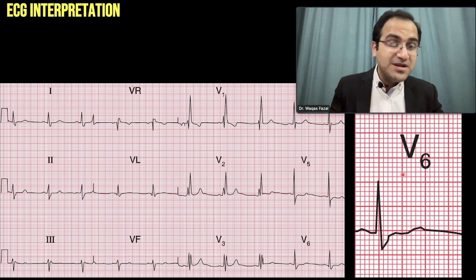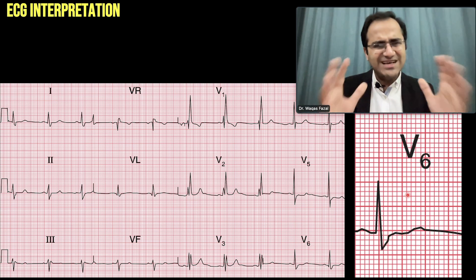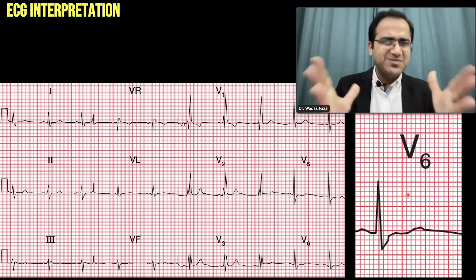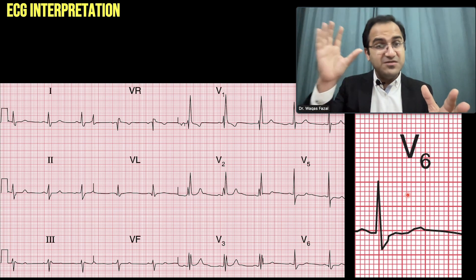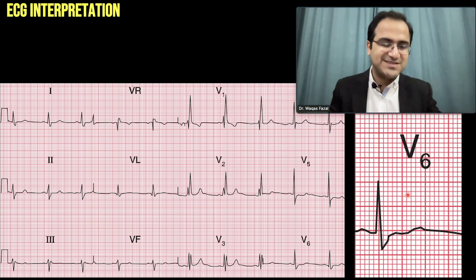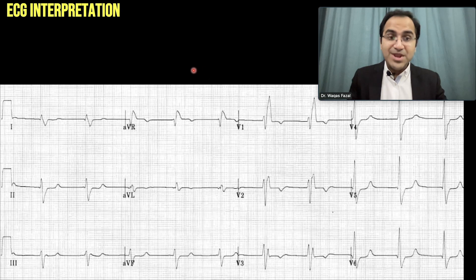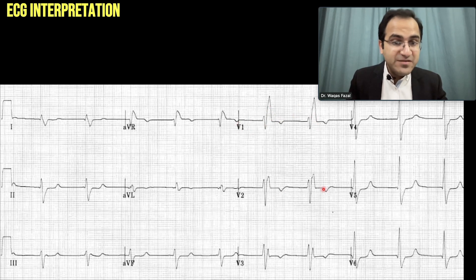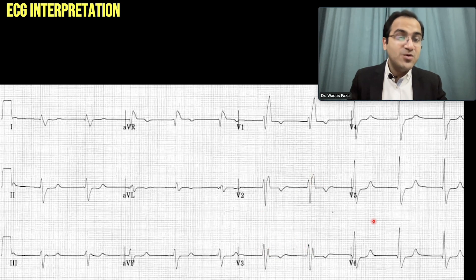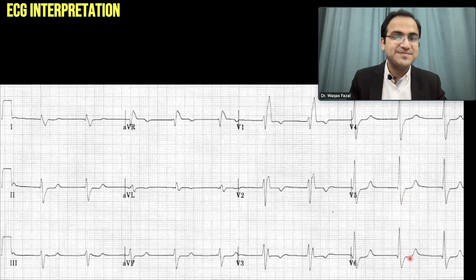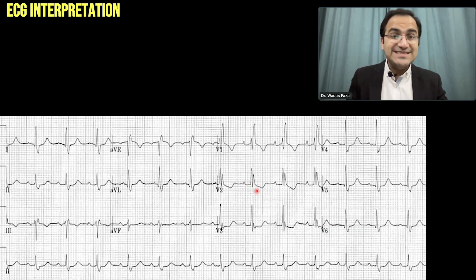This is how V6 shows slurring of the S wave — note the pattern of the S wave. This is the classical feature of right bundle branch block: M wave in V1 and V2, and slurring of the S wave in V6. Looking at another ECG, look at the M wave in V1, the M wave in V2, the M wave in V3, and the slurring of the S wave in V6.